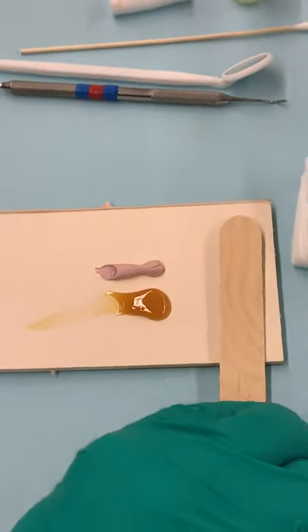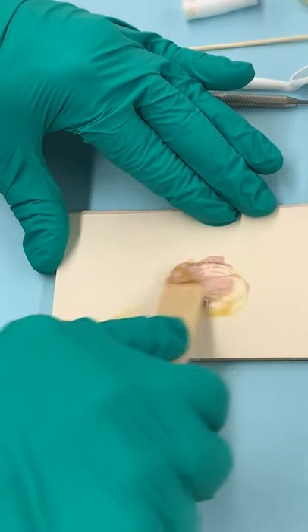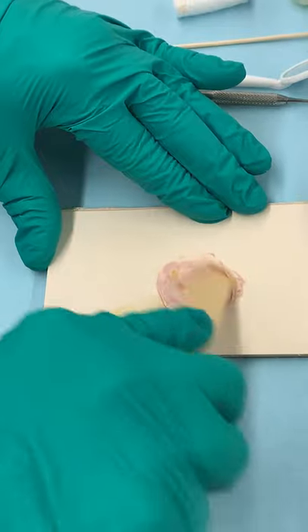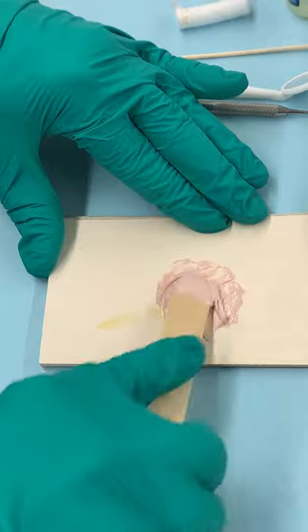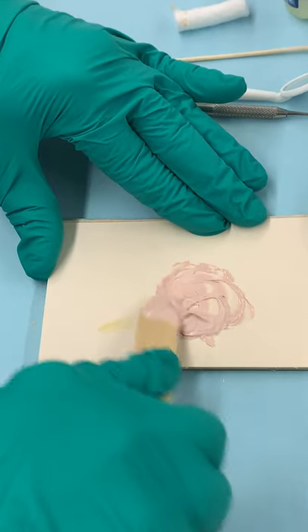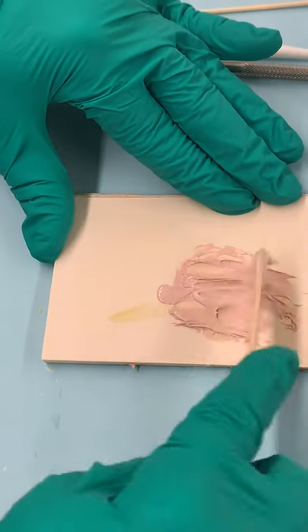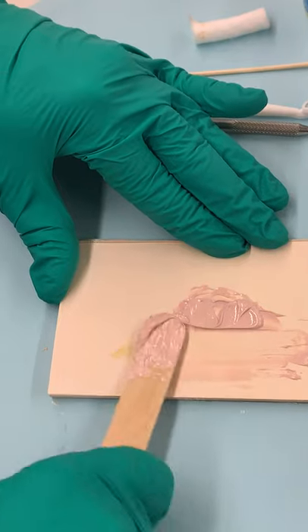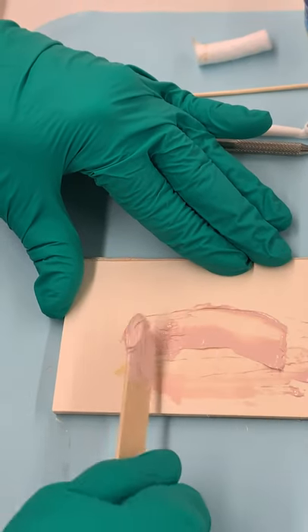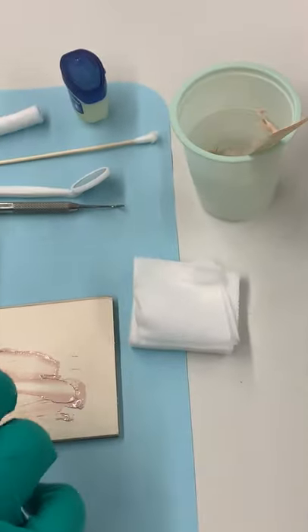I have the catalyst and the base, and we're going to use a tongue blade to mix that — just swirl it around, keep it in a small area. This stuff is really sticky, so you just want to make sure it's all mixed into a homogeneous mixture. Then we're going to scoop this up and place it in a cup of water, which is going to help it become not so tacky so we can work with it.